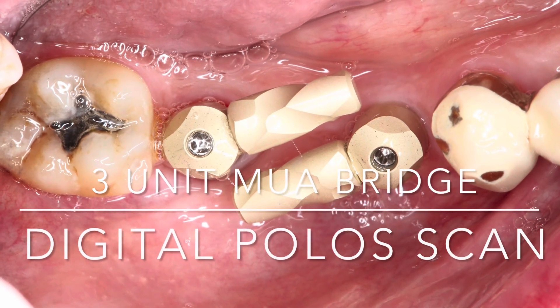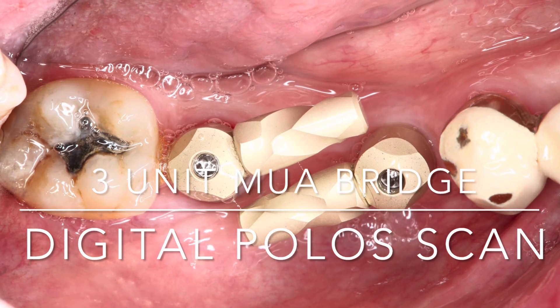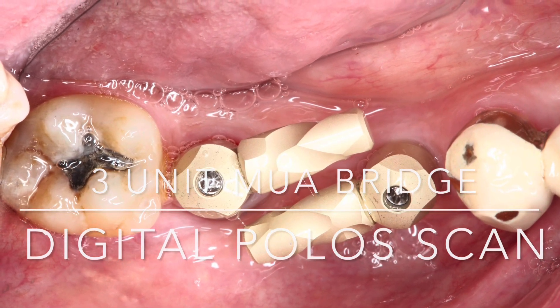During this case we'll be discussing the fabrication of a three-unit bridge using a digital protocol called the Polo Scan Bodies.